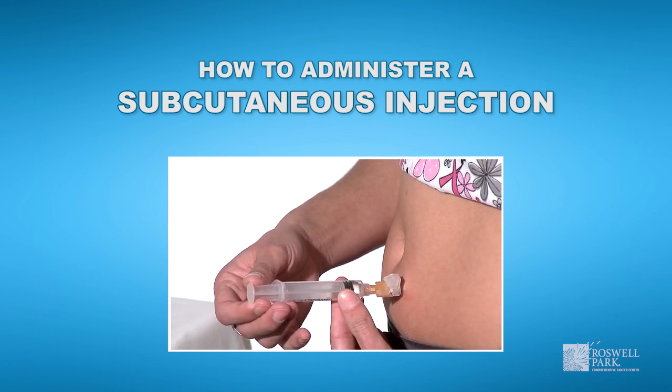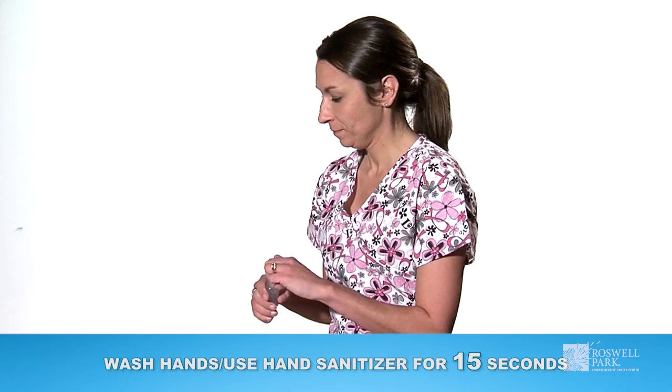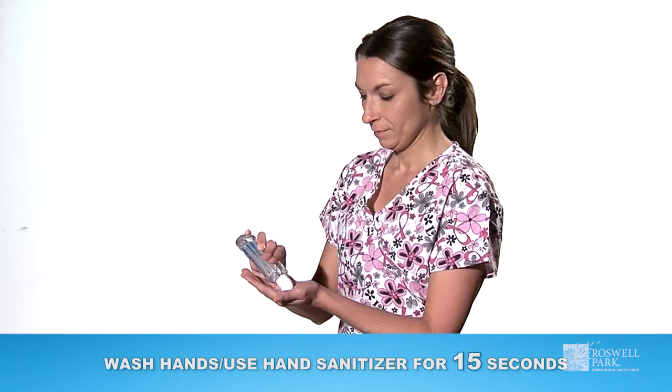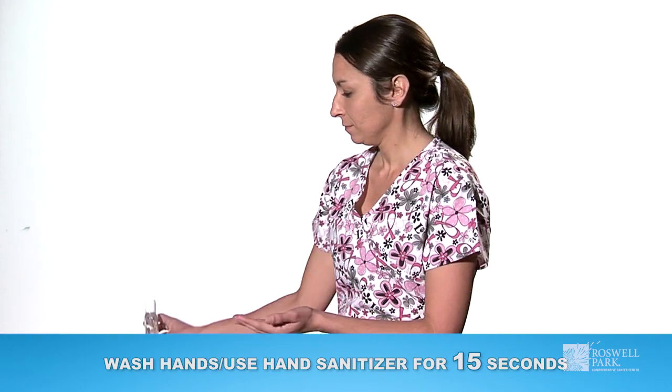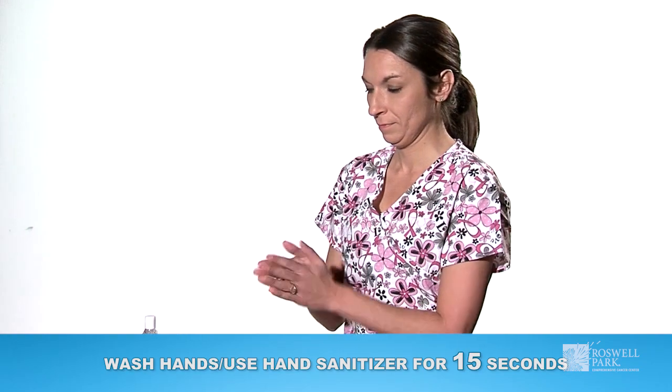First, you will need to wash your hands thoroughly with soap and water for 15 seconds. You can also apply hand sanitizer and rub into your hands for 15 seconds.